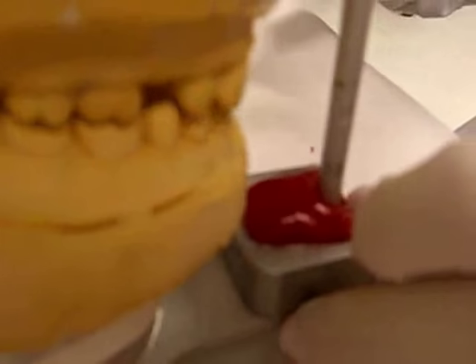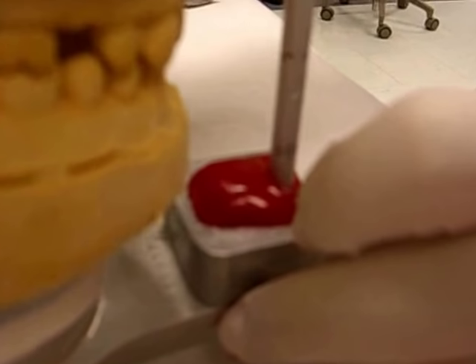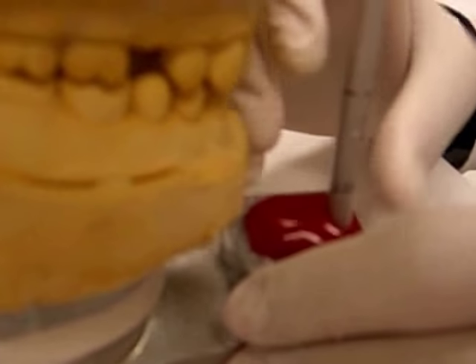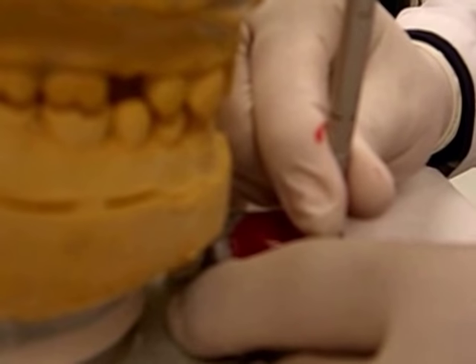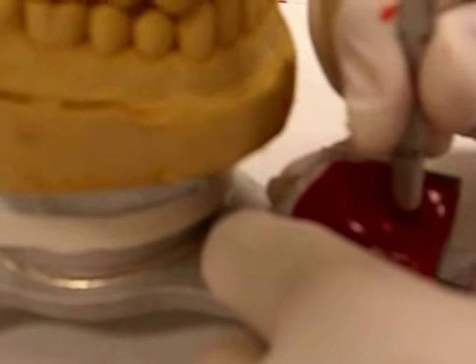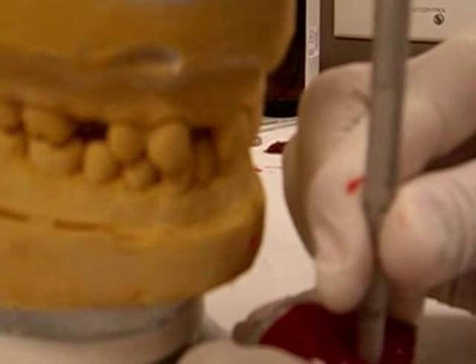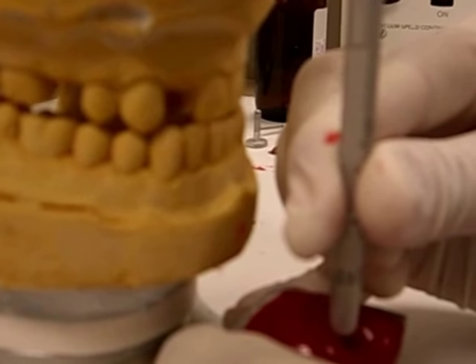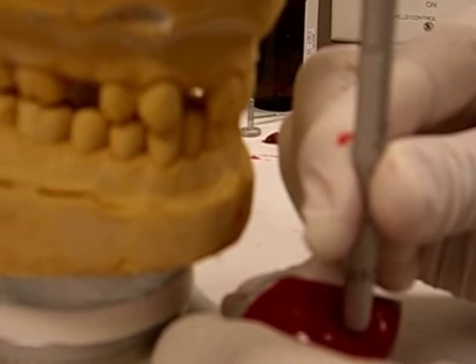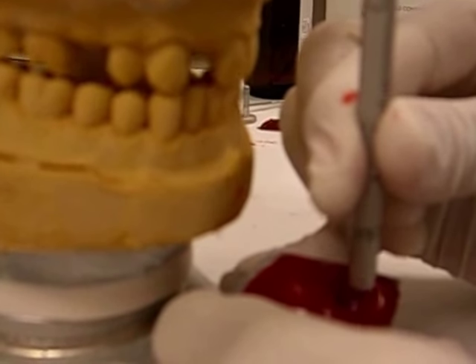Now it's time for me to start recording. Note that I loosen the articulator so I can have freedom of movement. I'm going to start with the protrusive movement — all the way edge to edge. I do it a few times to make sure I record that movement. And then we're going to record the canine guidance.